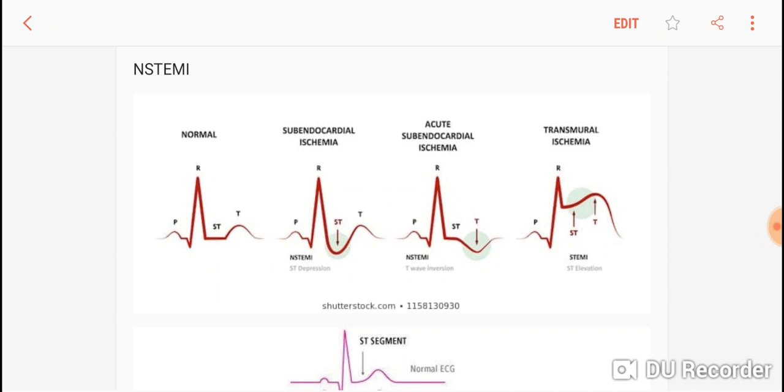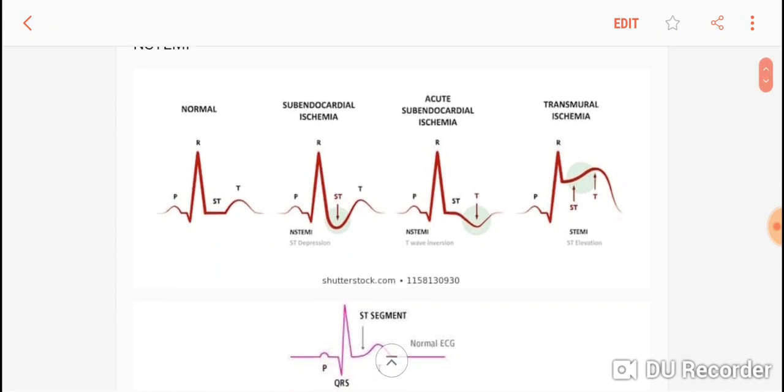First figure is a normal ST segment, T wave is upright. In the second figure you see an ST that is depressed, it's gone to the downside, T wave is upright. It can be an NSTEMI, non-ST elevation MI. It's an MI but the ST segment is not elevated.